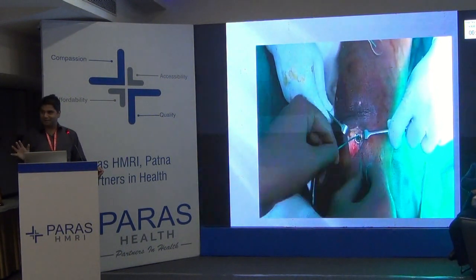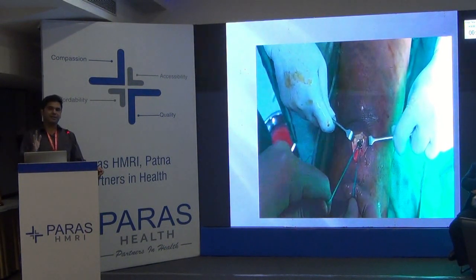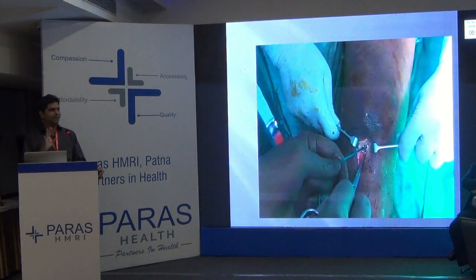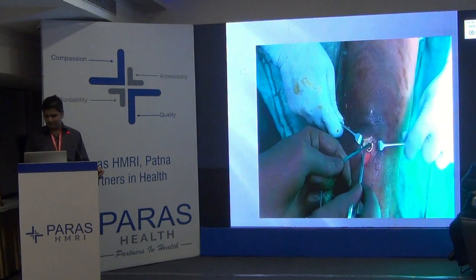Somebody who is not doing it regularly might think that this is a very flimsy kind of fixation, but believe me, I am not giving a long knee brace to any of my patients, and for almost 12 years I am doing this fixation only, and nothing is failing. It is a very sturdy situation.